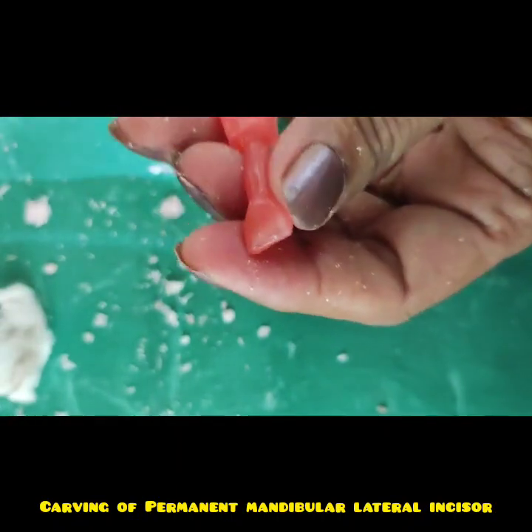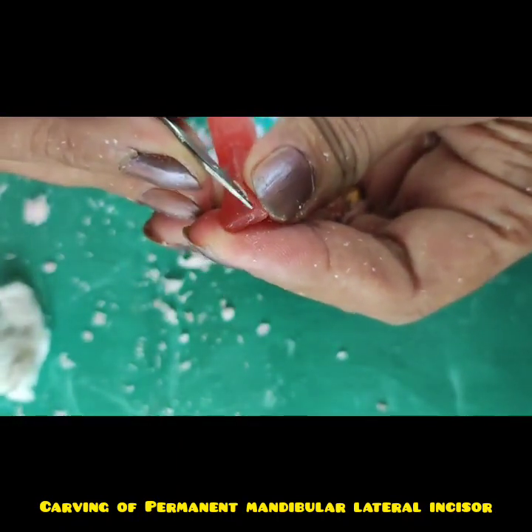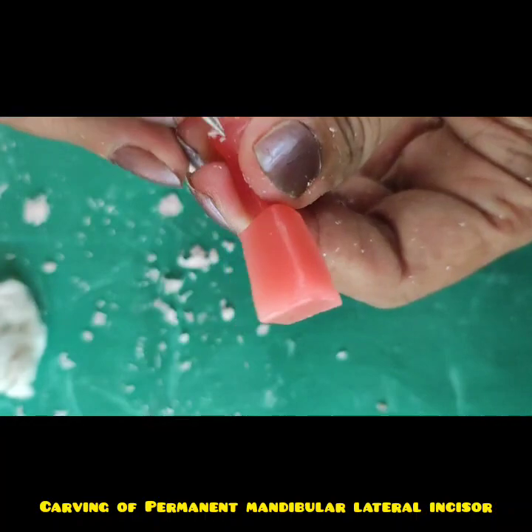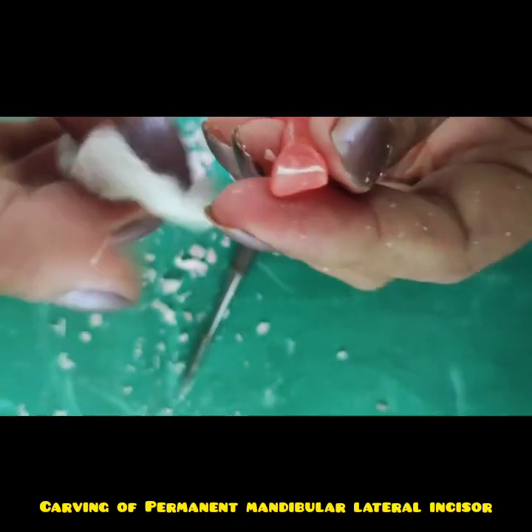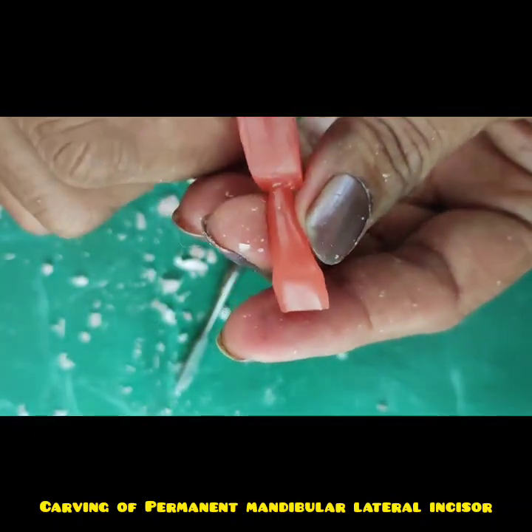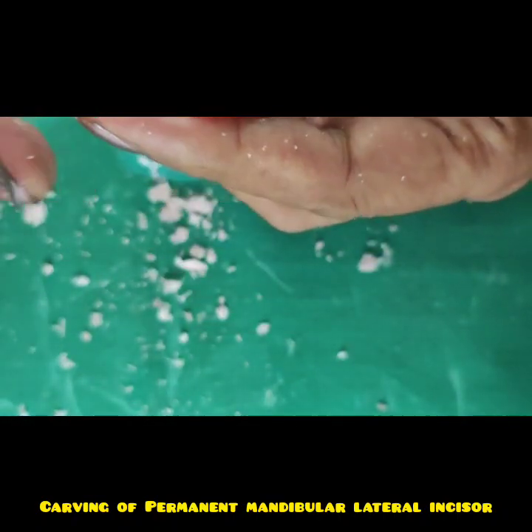Now carve the fossa, same like the incisor, same like the maxillary central incisor and other incisor. You can see the fossa with incisal edges, incisal marginal ridges.